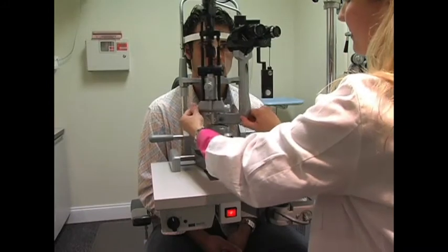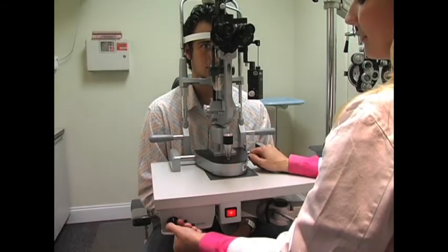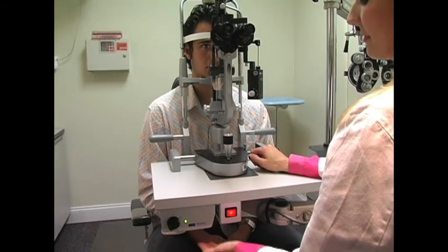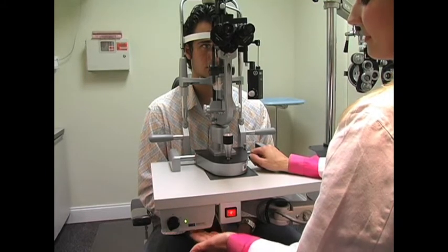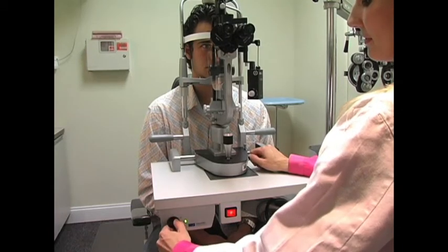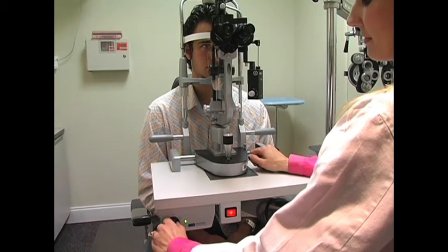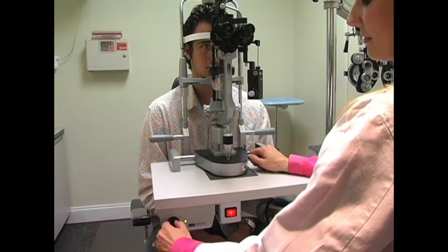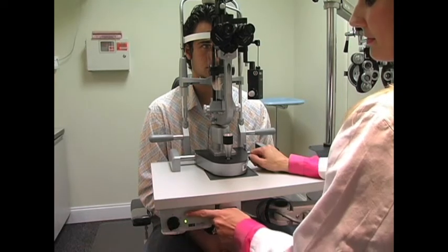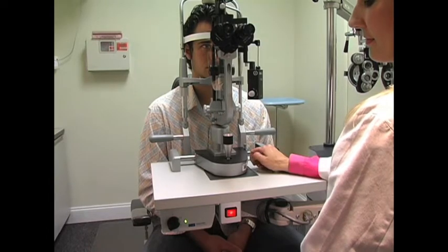To start, make sure the light source is in the neutral or midline position. Find the on-off switch and turn on the light source. Typically on the Haag-Streit slit lamp, this switch will be located on the underside of the table. This switch also allows the provider to vary the intensity of the beam by varying the voltage. Typically the slit lamp should be operated at 5 volts or half strength so as to prolong the life of the lamp bulb.